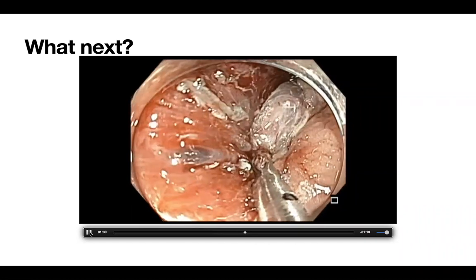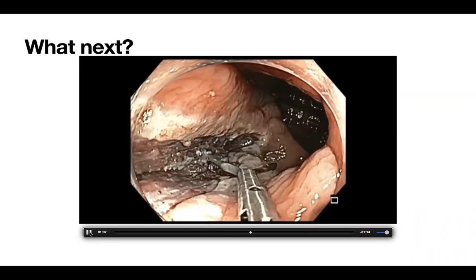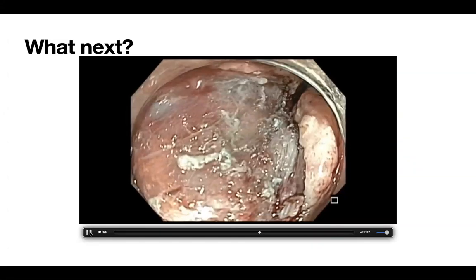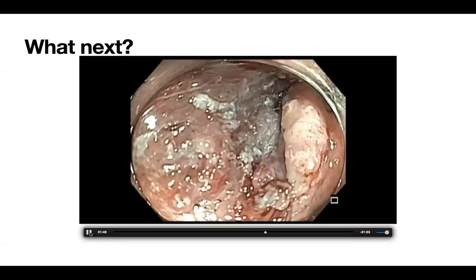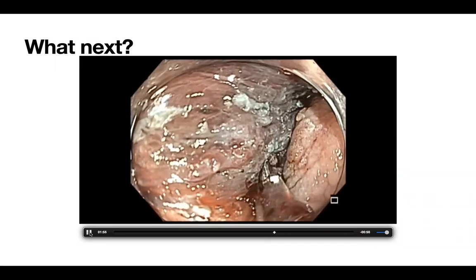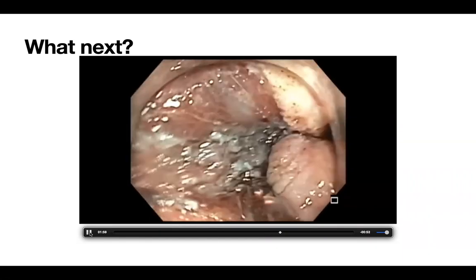So when I tamponade like that, I did not want to deploy the clip. I wanted to sit there for 5 minutes. I sat there for 5 minutes and reopened and looked like we were able to achieve a nice thrombosis there. And I thought, okay, maybe I should seal the vessel. And this time I applied the coagulation current.